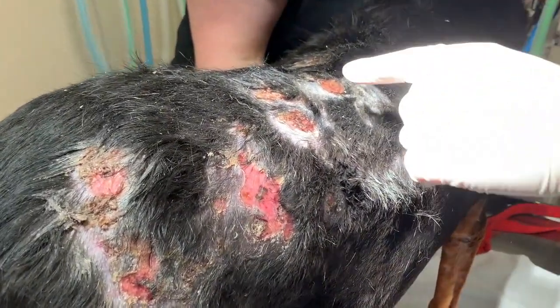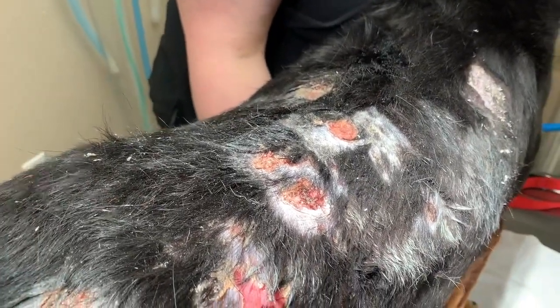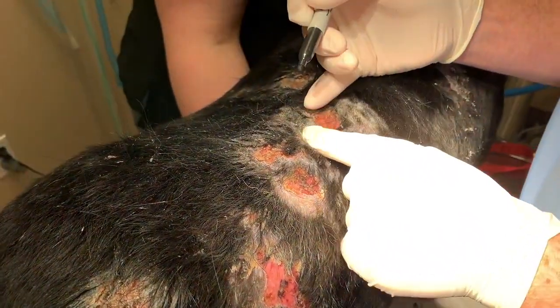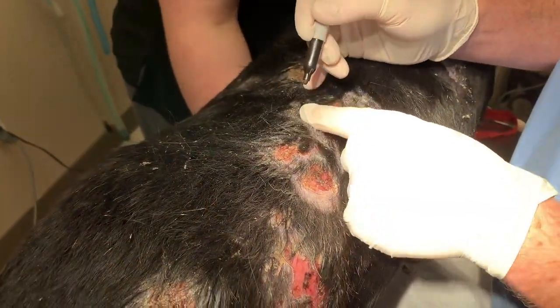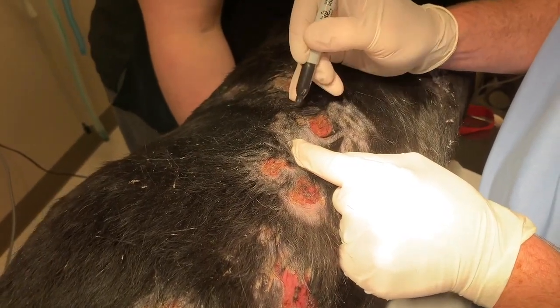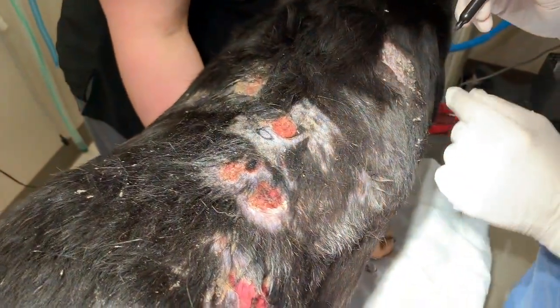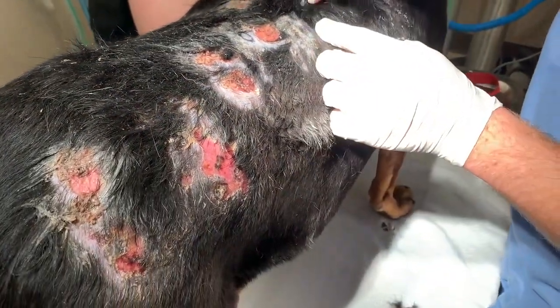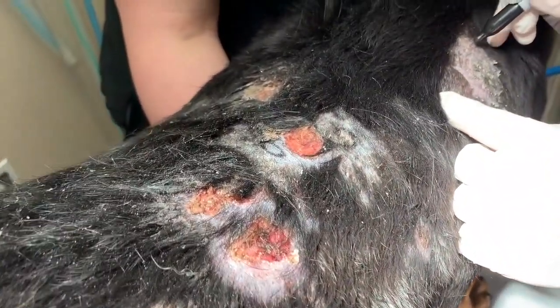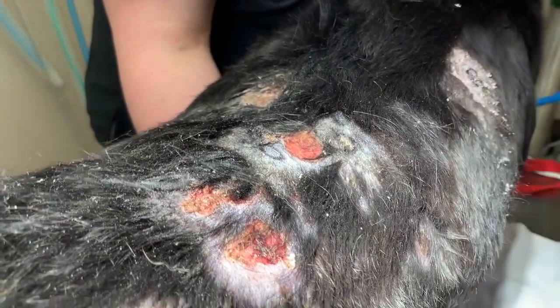We're going to mark the spots with a Sharpie that we're going to biopsy. So one we'll do on the margin of this lesion, maybe through this area, and just draw a little circle there — through this crusted area, and then again through this crusted, scaled area.